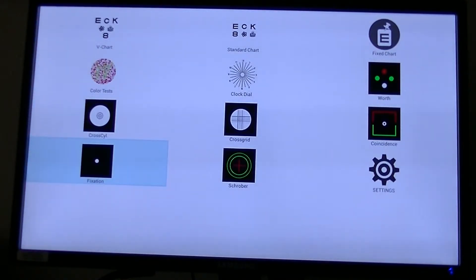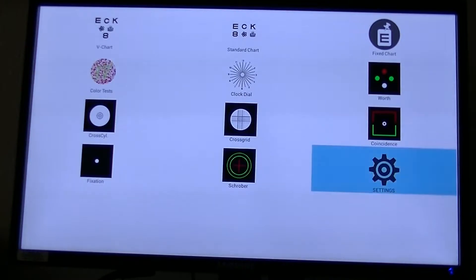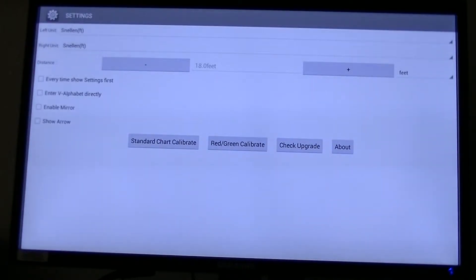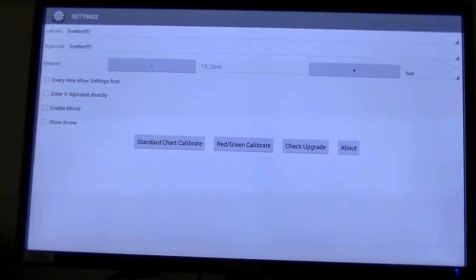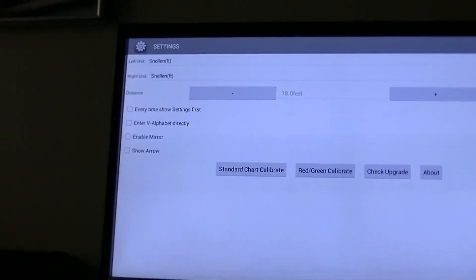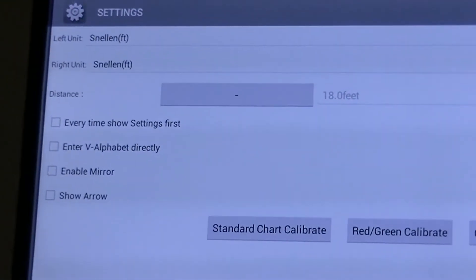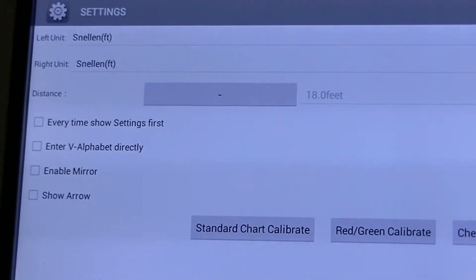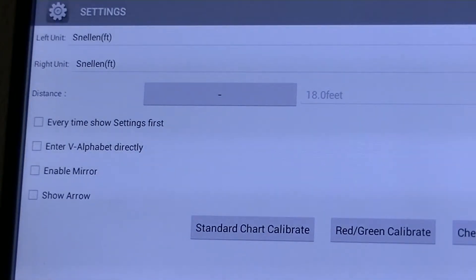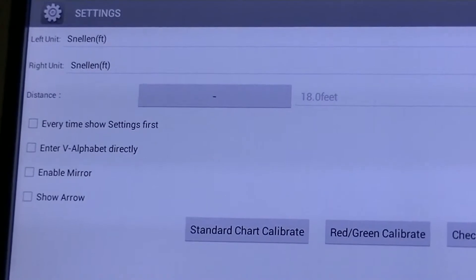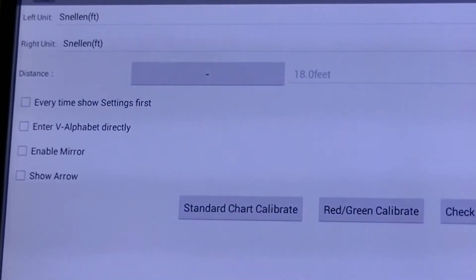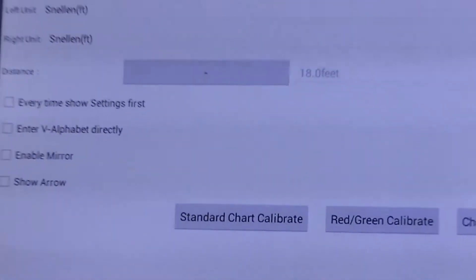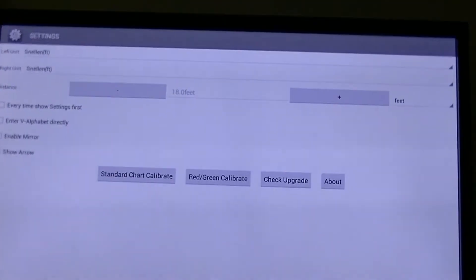So down, down, down, and then to the right, to the right — then we're going to enter into settings. Now here on the side you have left unit, right unit, Snellen feet — that can be changed. The distance — you can see we are set for 18 feet. And there's a plus there and a minus over here.